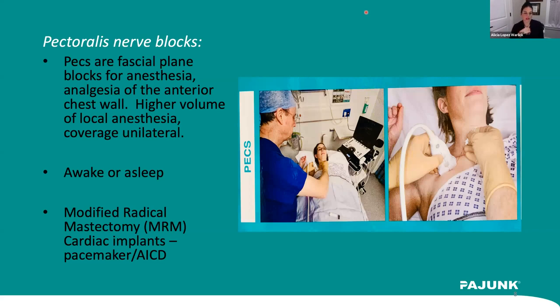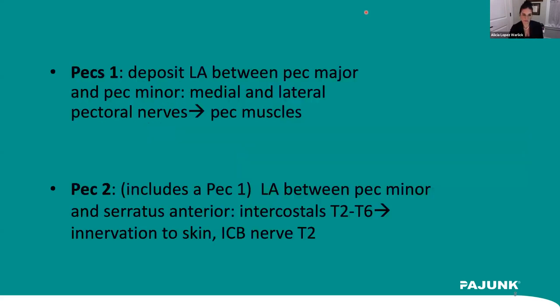I have the luxury of sometimes doing my blocks in the operating room after induction. So I'll show you in some of the pictures that follow how I do the block when the patient is asleep. But if you were to ask me how I like to do my PEX blocks, I'd rather just do them asleep because of the anxiety level of a lot of these patients.